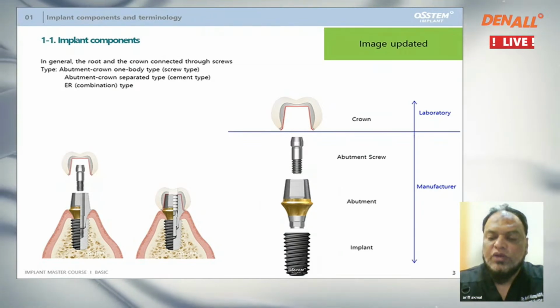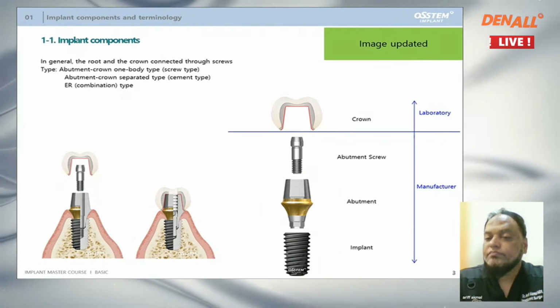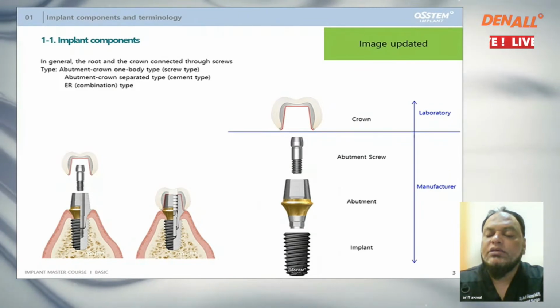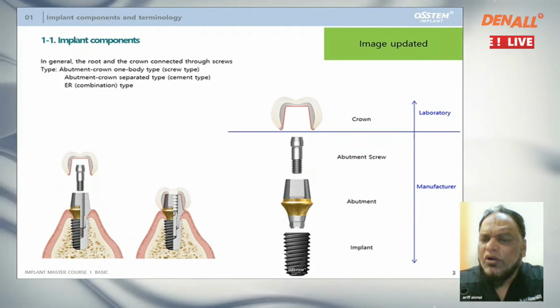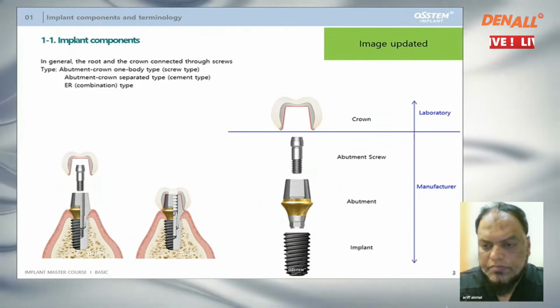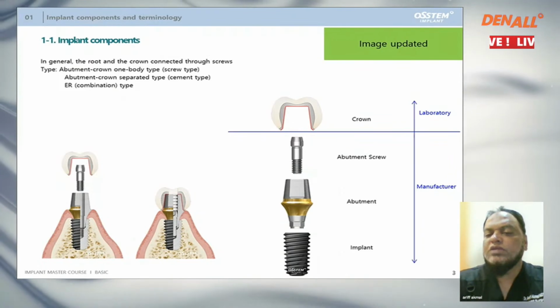And lengthwise also, I'll have one of 11.5 and one of 8.5 as well. That day, without doing the implant, I had to close the osteotomy and suture it off. It gives a wrong impression to the patient. So make sure when you start practicing implant dentistry, you have the stock of implants before you start the case.